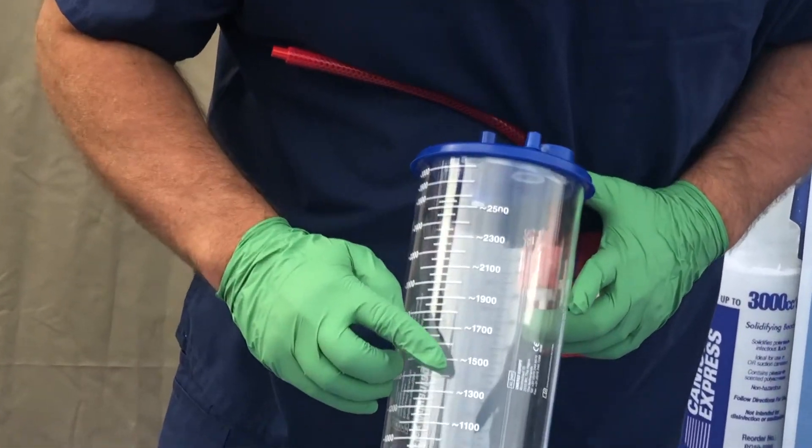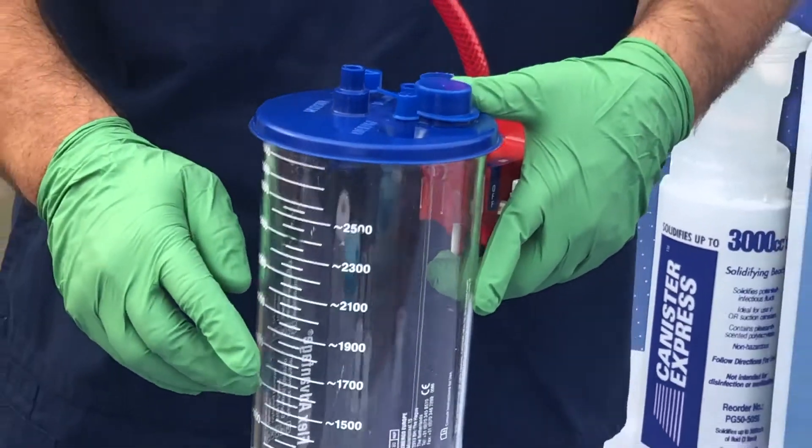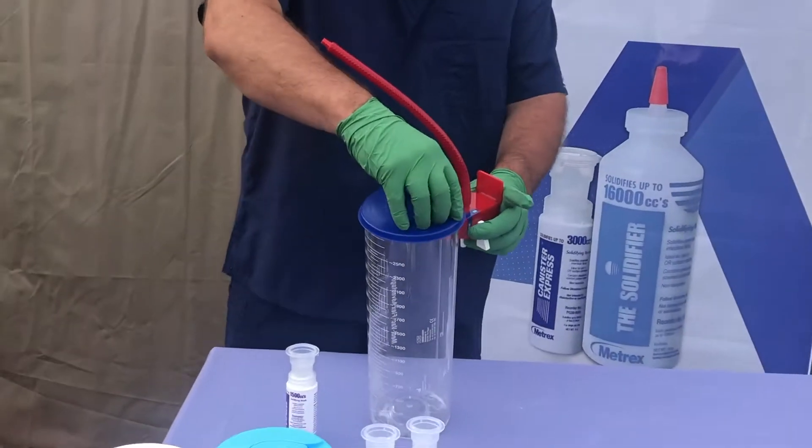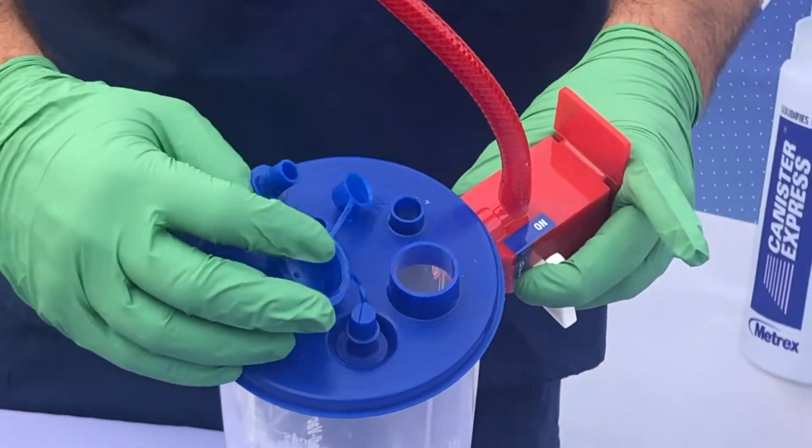To use Canister Express, open the top of the empty suction canister and lock the Canister Express PremiGuard cap into place. This occurs during procedure prep, before there is any liquid in the canister.